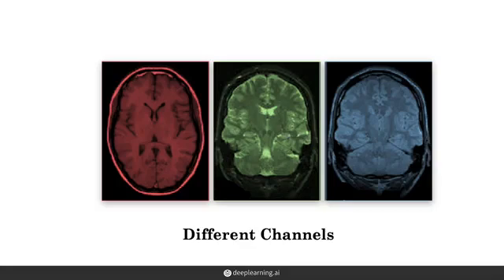The analogy of the 3 channels representing the RGB channels is mostly useful for us to visualize how we're going to combine the channels. There's nothing special about the number 3. The idea of using different channels also extends to when we may have 4 or 5 sequences, which can be represented with 4 or 5 channels.